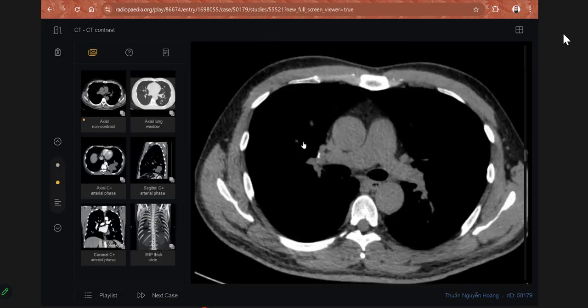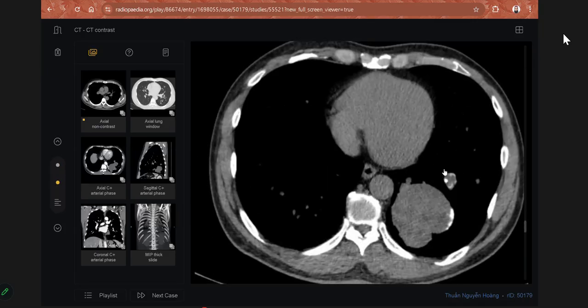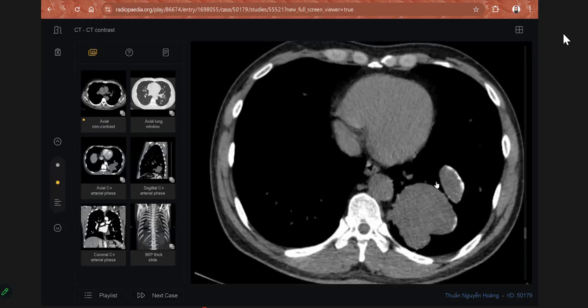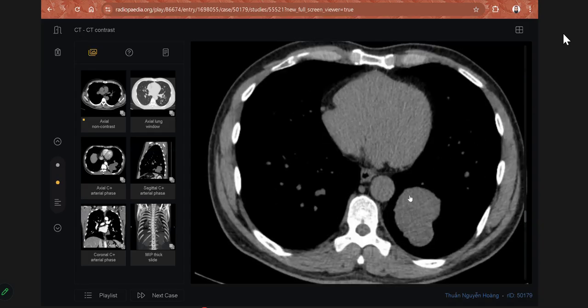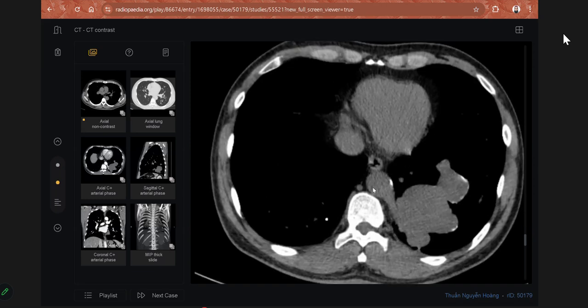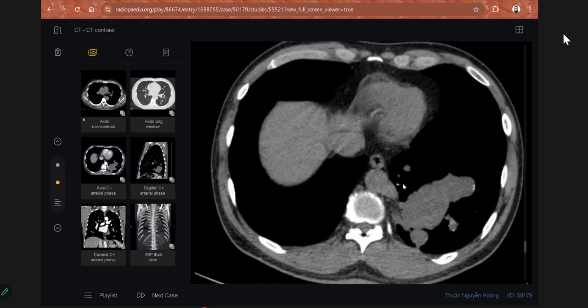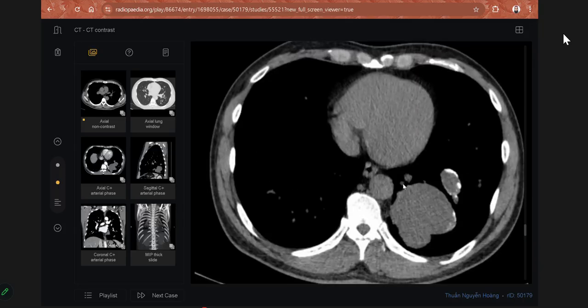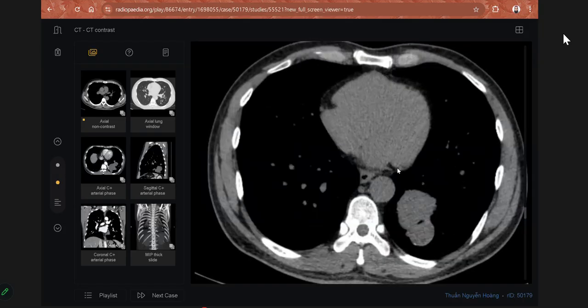On CT, when I provided it, you picked that there is an aortic supply, with suspicion of sequestration, with peripheral calcification, a lobulated, homogeneous lesion. Post contrast, I tell you there is a supply from the aorta, then you tell me the differential. So overall, your performance was good. You picked the pathology in your first instance, like your first candidate. You both performed well. Best of luck for your exam.